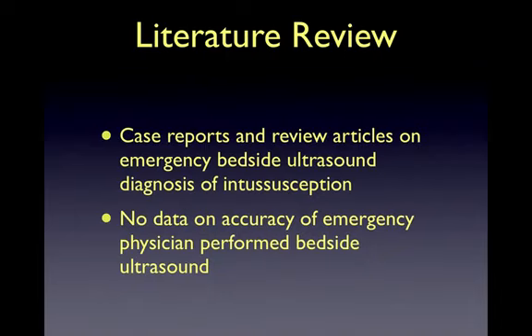There have been case reports and review articles published on emergency bedside ultrasound diagnosis of intussusception in the pediatric population. However, so far, there has not been any clinical trial on the accuracy of emergency physician performed bedside ultrasound in diagnosing intussusception in children.